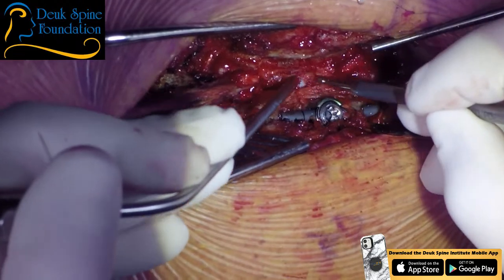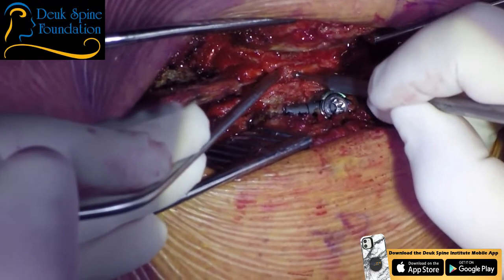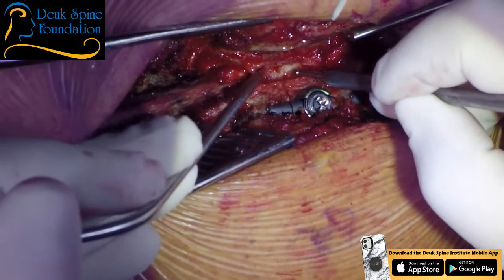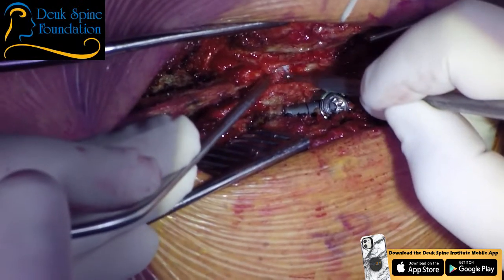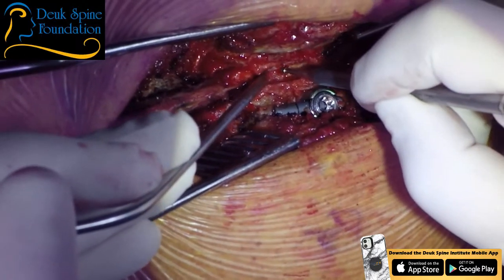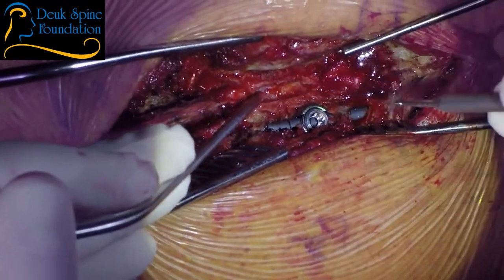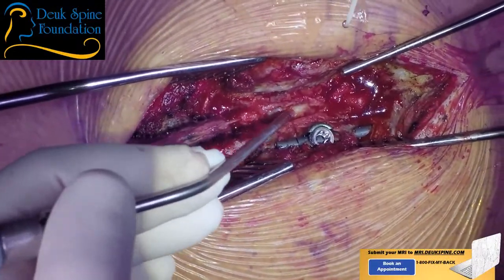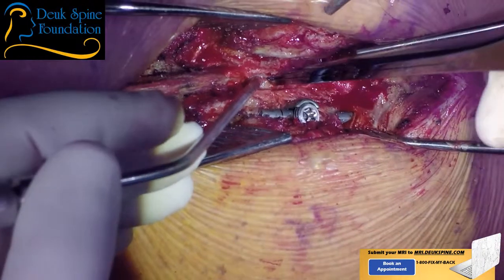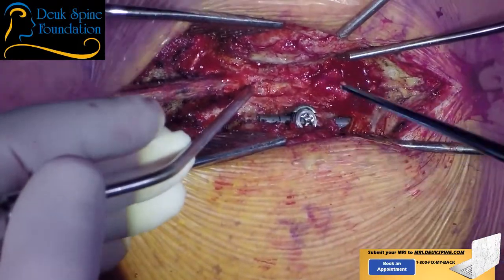That's the inner cortical bone right there. I need to get through that to be able to start getting rid of some of this inner lamina. Typically, when you get through the diploic bone, you'll see a little bit of epidural bleeding. The trick is you want to leave a little bit of bone just so you can grab onto something and bite it out. Otherwise, you're going to have a hard time removing it. Now, if you just have ligament to bite, you want to leave like a little eggshell.